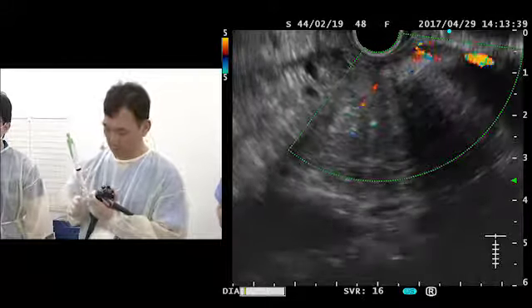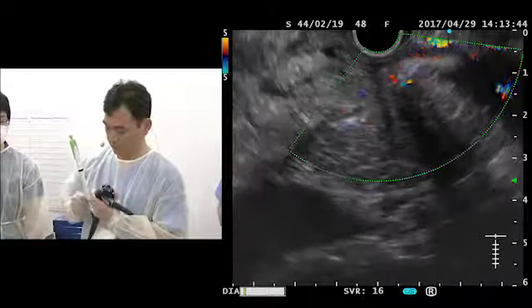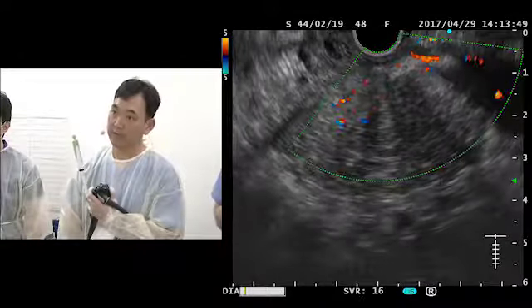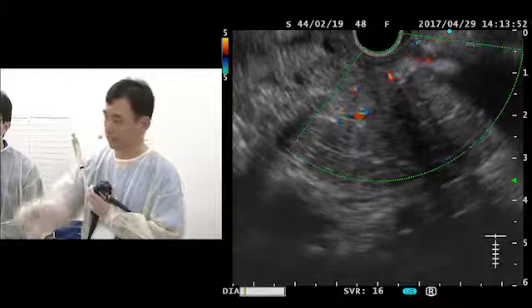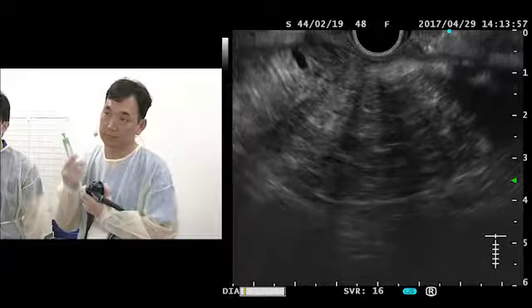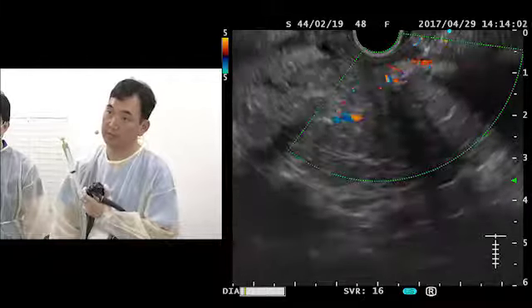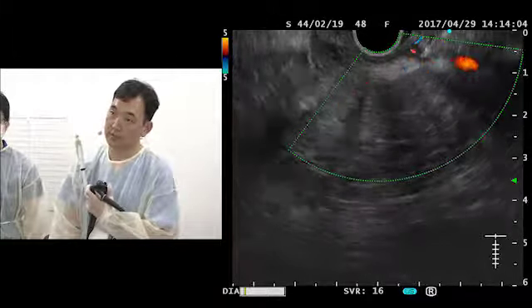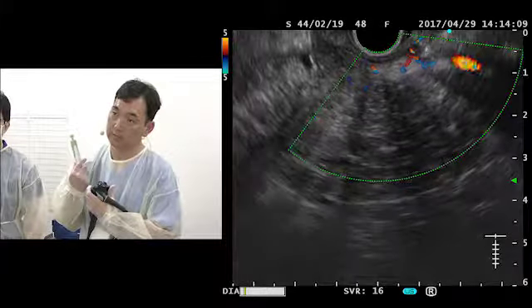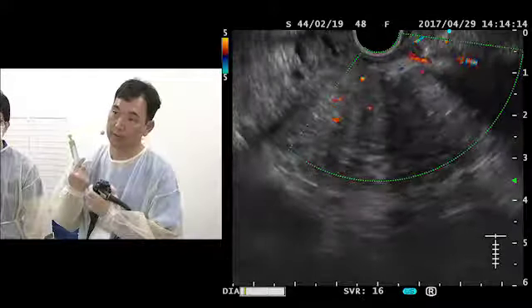One more thing is this Acquire needle has a blunt stylet. So when you're ready to puncture, you have to withdraw the stylet. On the right upper side, there's a needle stylet here, so I know exactly where my needle is coming out from, and I'm making sure that I'm avoiding the big artery, which is kind of difficult to do, and targeting the area of interest.